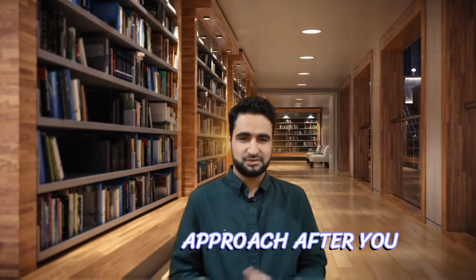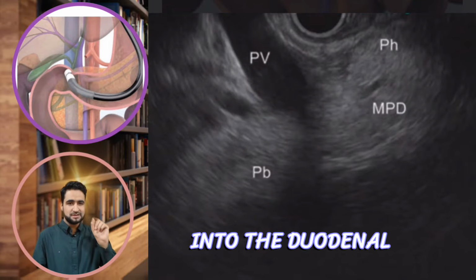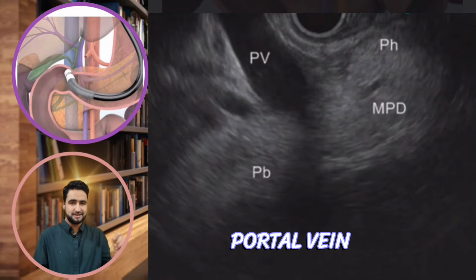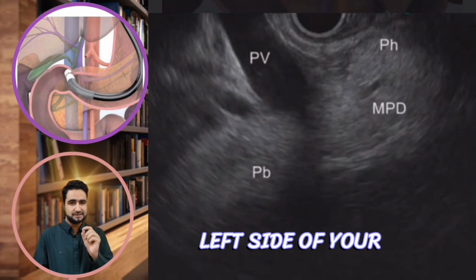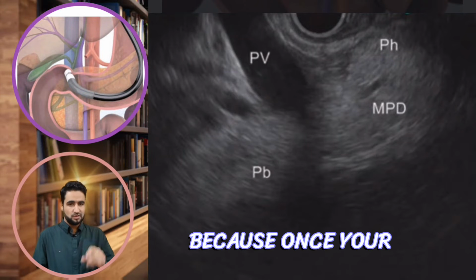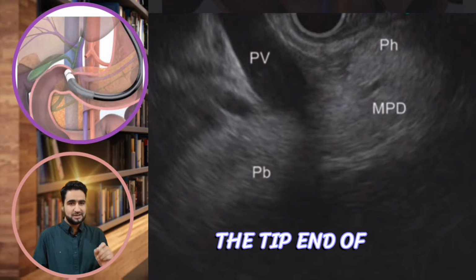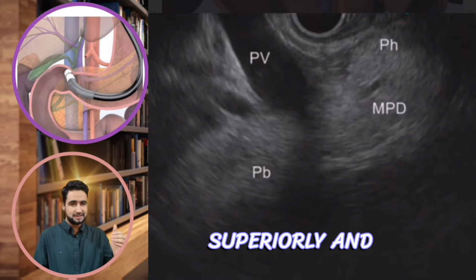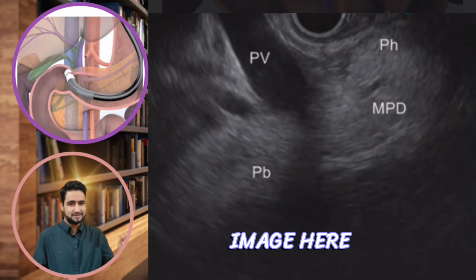Let's start this approach. After you insert the scope into the duodenal bulb to image the portal vein, you will look for portal vein on the left side of your screen. Because once your transducer is in the duodenal bulb, the tip end of transducer is superiorly and shaft end inferiorly. You can see it in the image here.